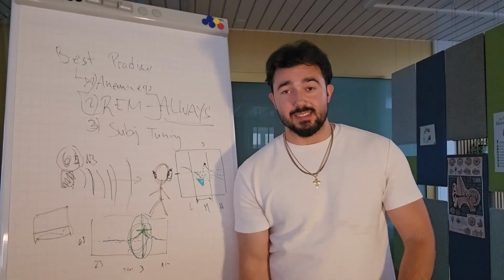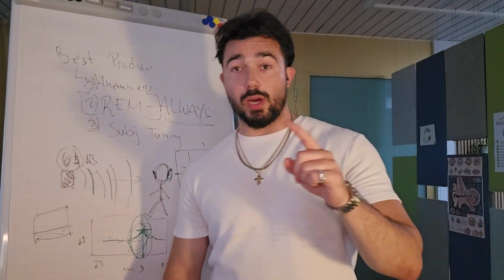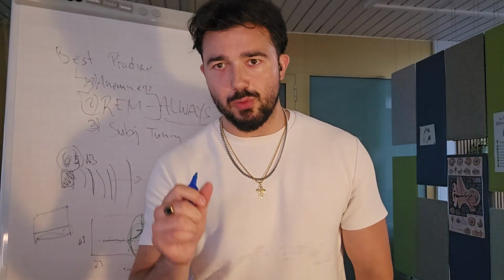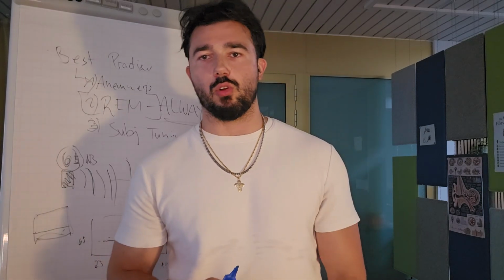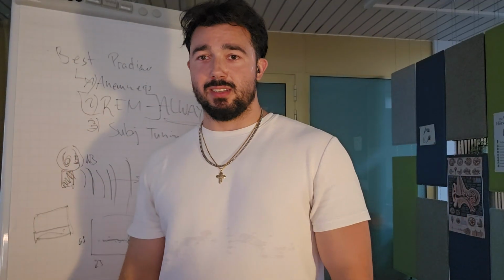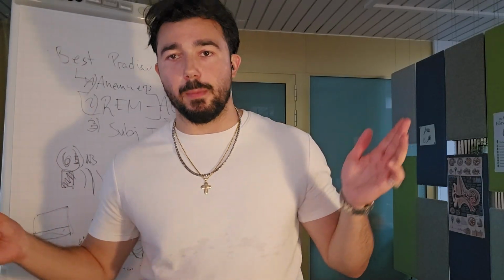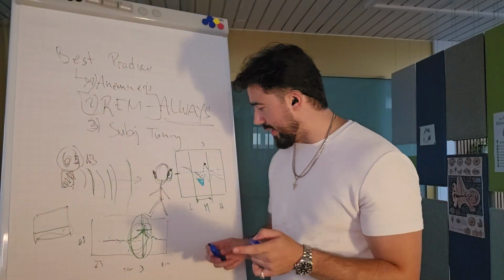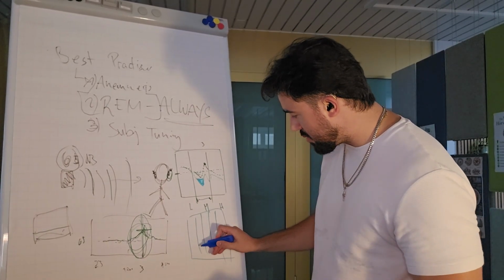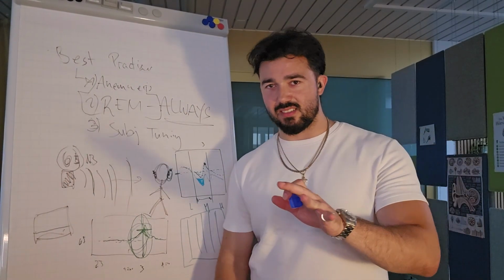What you could be doing instead is get the cheapest modern hearing aid any provider has to offer. Why? Because first of all, the cheapest ones now are pretty much the high-end devices of 6 or 7, maybe 8 years ago. Imagine that. 8 years ago, they would have charged you 7, 8, 9,000 for a hearing aid that today is worth maybe 1,000, right? But this hearing aid probably has at least 6 such sliders.